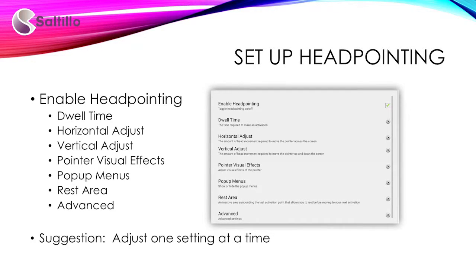In order to fine-tune the experience for the user, there are many customizable options available to them. The settings will be particular to the individual, and it is strongly suggested that you adjust one setting at a time to get the ideal combination of settings for the individual. If you adjust more than one setting, it is difficult to know what to change if something isn't working well for them.